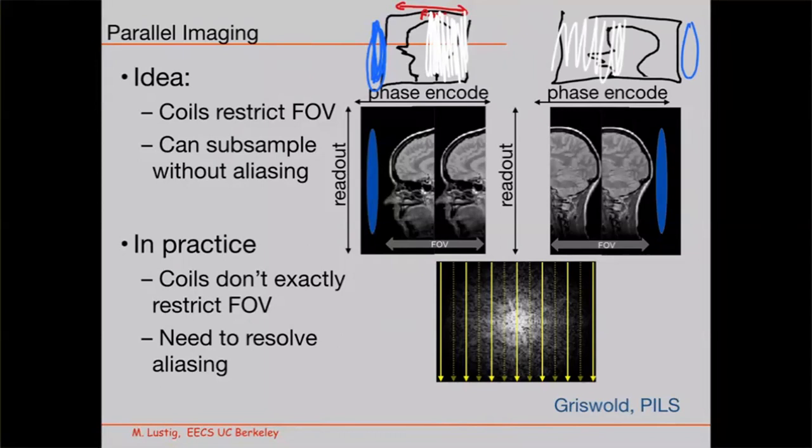So if I collect all of K-space, I get an image that has half a head and half empty. And here I'll get an image that's half empty and half a head from the other coil. Then I combine those two just by adding them, right? That would work perfectly well. Or I can just crop this part and stitch it to this part.